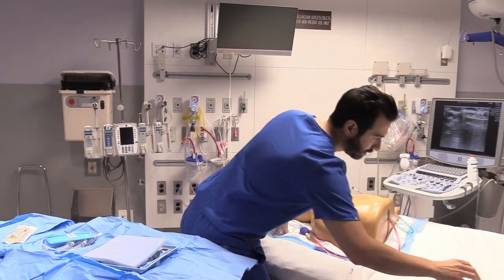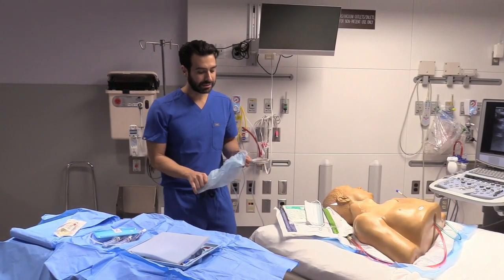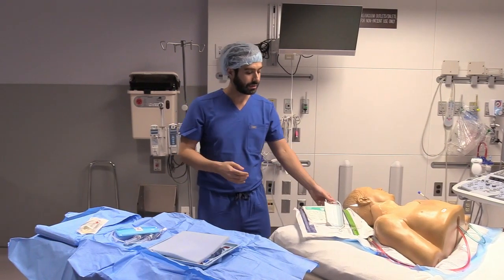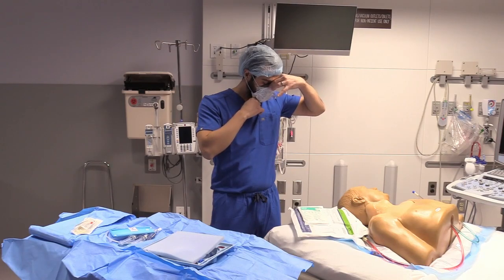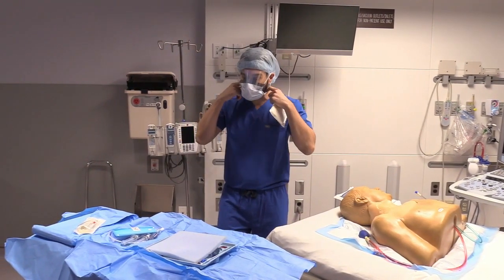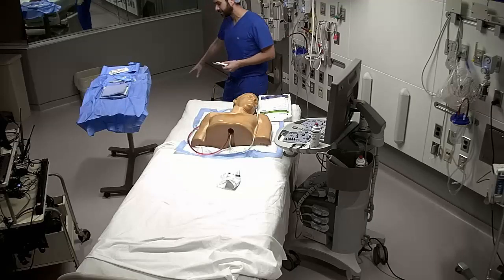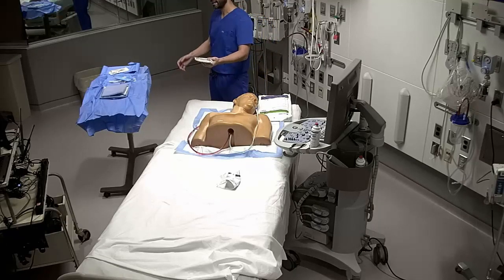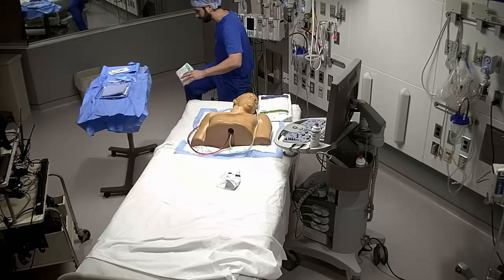You've already prepped the patient once, and everybody kind of does this differently, but I think, wash your hands, clean your hands first, place your mask and your cap on. I think if there's a bunch of wires, and I'm going to take this off just so it's easier to hear me, but once there's a bunch of wires here that are connected to the patient or lines or IV tubing, a lot of it is in an arm or in the leg. So I actually try to move the poles if I can down there so that everything isn't draped here and people are trying to step over that.